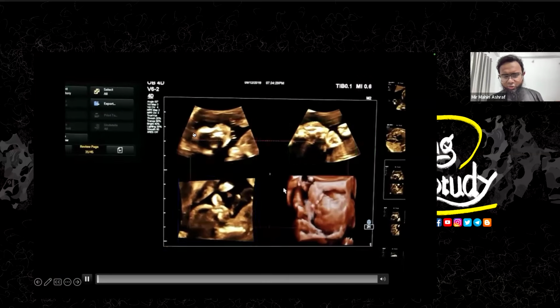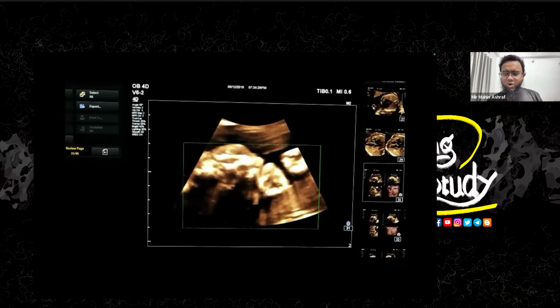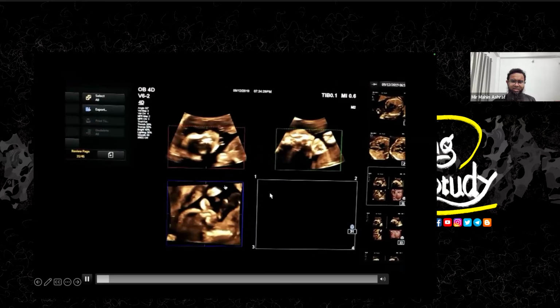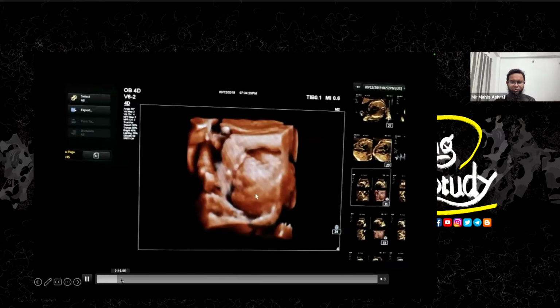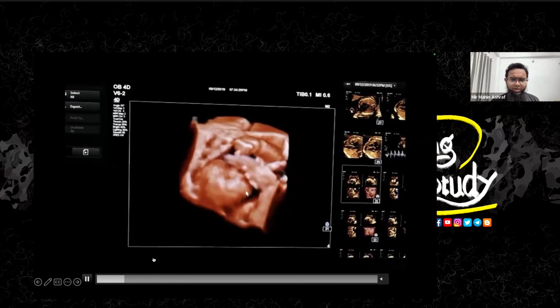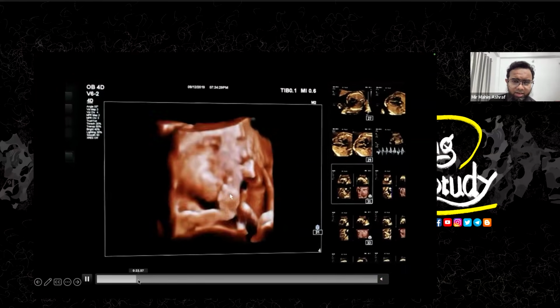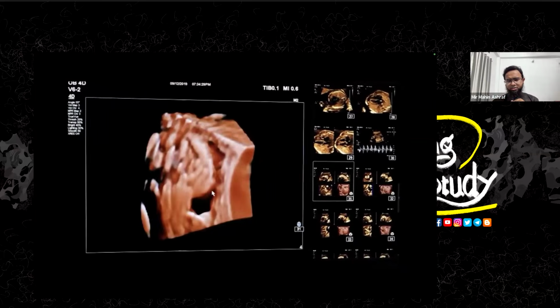Okay, so let me show you an example. I don't know whether it will get slower. So here is a 3D picture I have taken, and the image doesn't look quite good. So I will just try to edit it a little. So you can see that I'm rotating the image, and I'm just trying to think about the area I want to cut first.